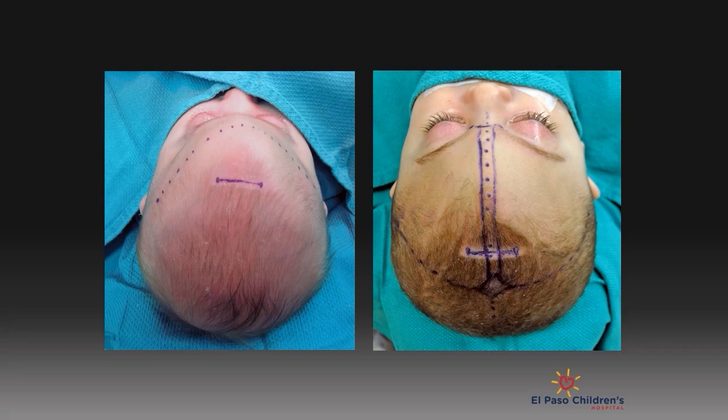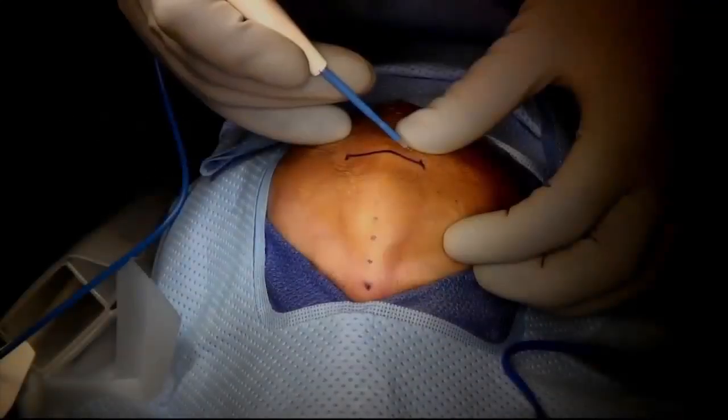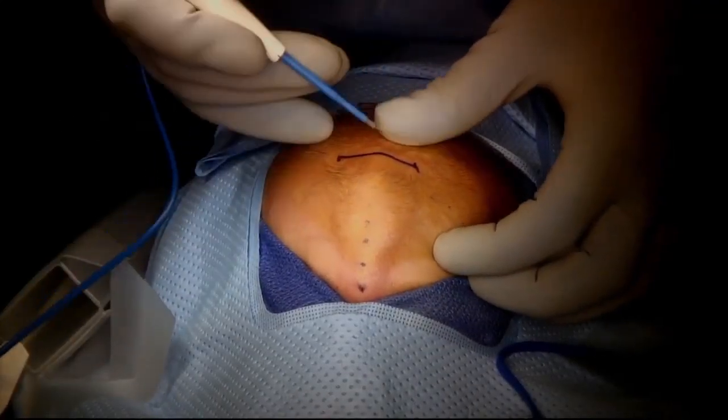Metopic synostosis can be successfully treated by releasing both frontal bones with the creation of a midline osteotomy, which extends from the anterior fontanelle all the way down to the nasofrontal suture. A small transverse incision is made behind the hairline as seen in these photographs. Presented here is our technique for treating metopic craniosynostosis endoscopically.